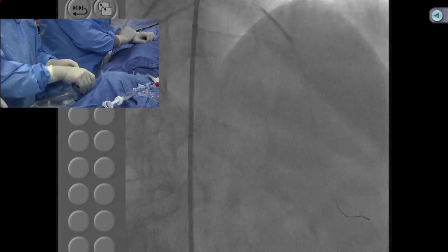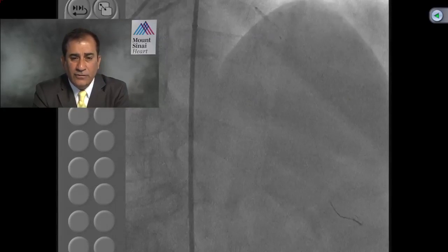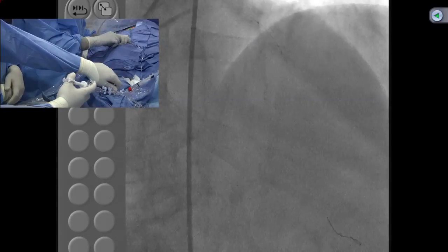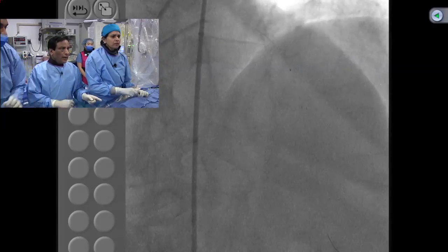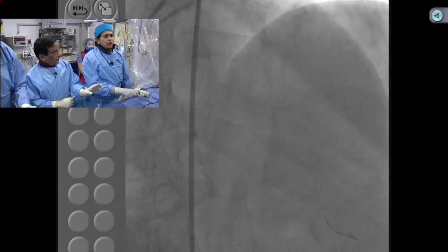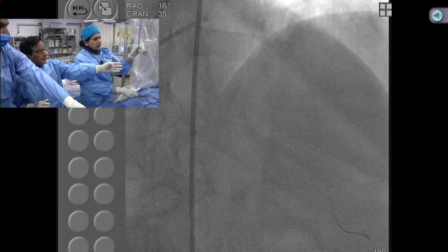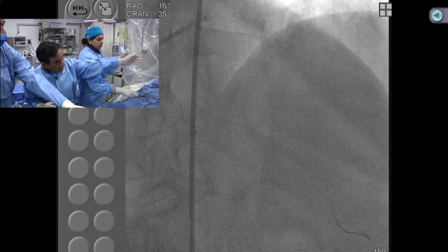But are you not realizing that you have fewer doubts and you're using the Progress wire earlier in the cases? Yeah, I think the point is we used to go with the various Progress wires, now we can go with only one. Progress T200. They start with 40, 80, 120, 140 and 200. We only keep the 200 T.